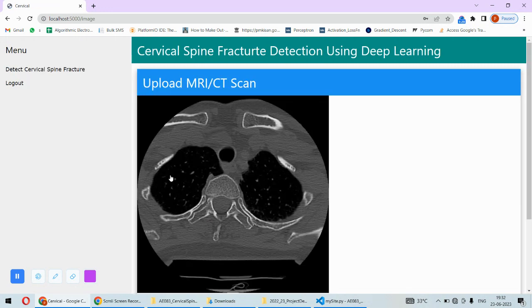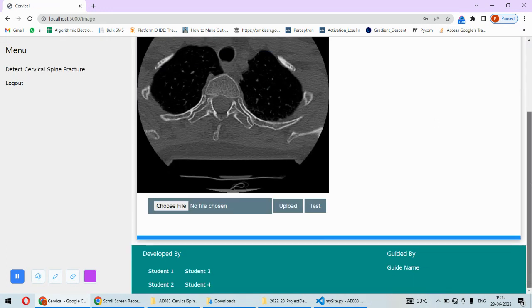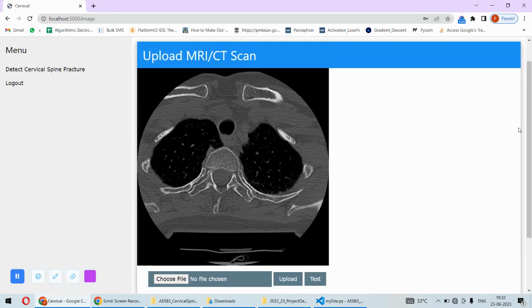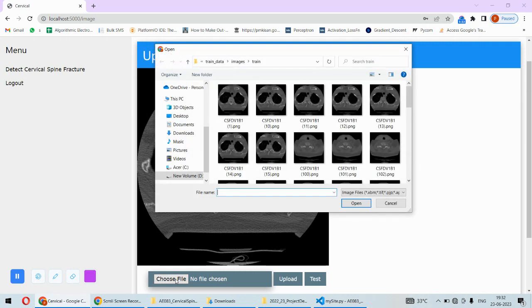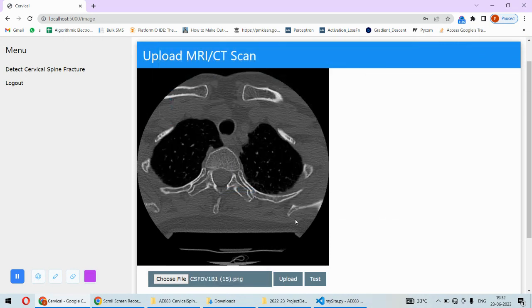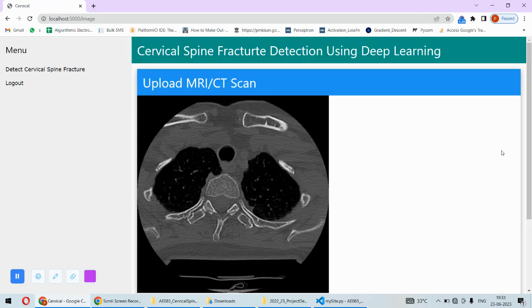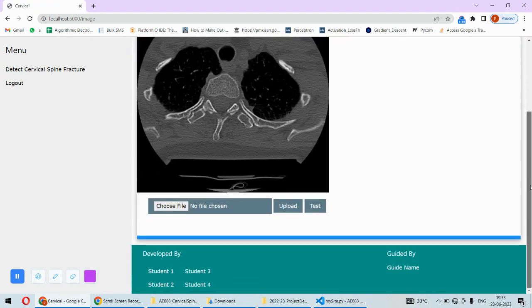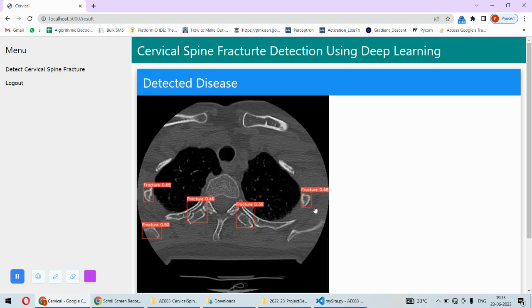Once you submit, you are on this page and here you will have to choose the spinal image. For example, I will pick this image and this is uploaded. Now if you click on the test, then I can get the indications.